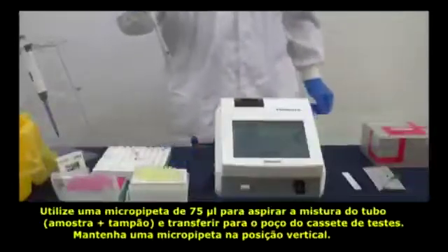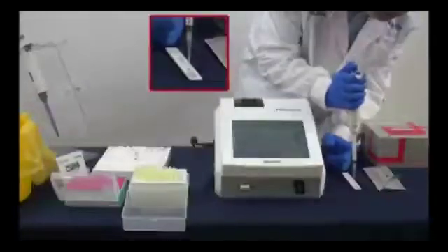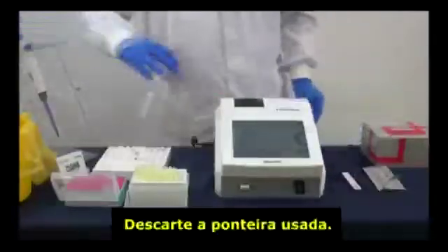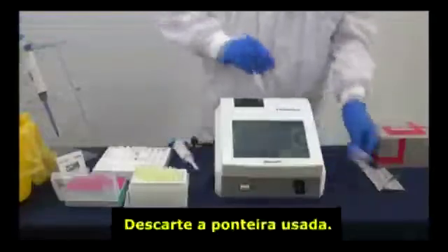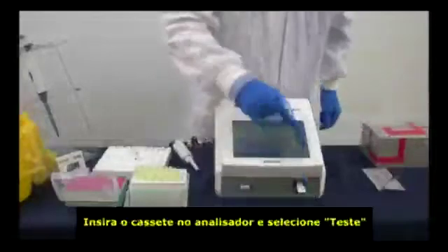Keep the pipette vertical. Discard the used tip. Insert the cartridge and press Test.